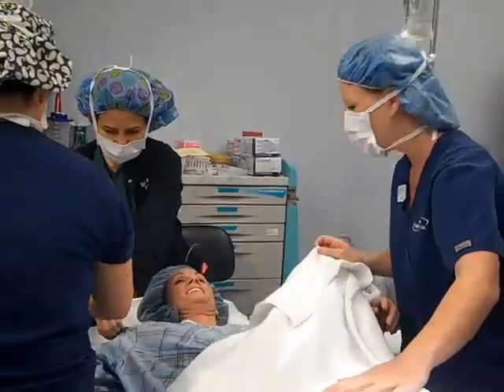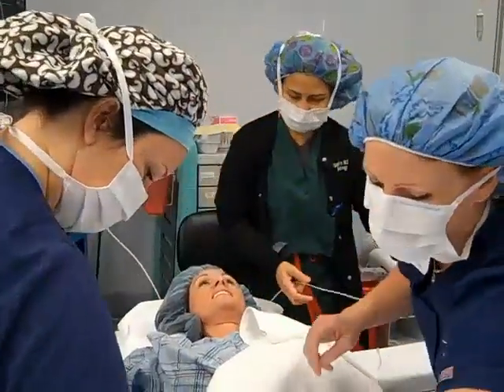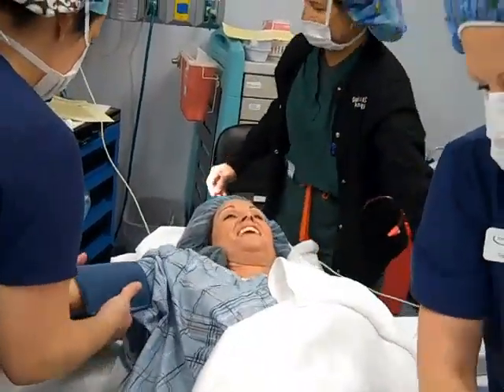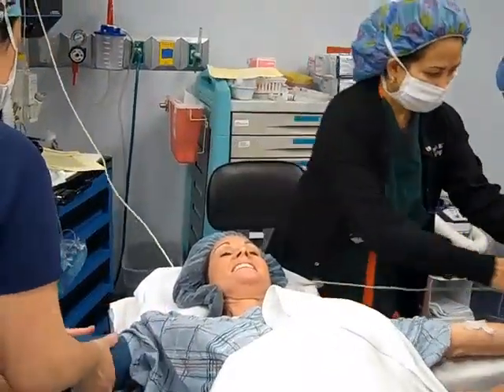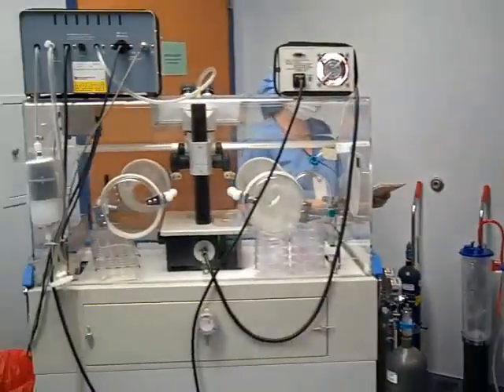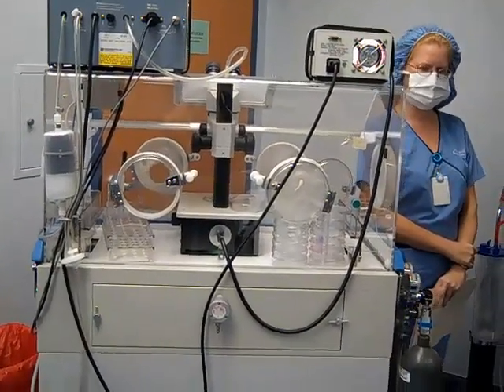We're going to be putting some monitors on you, okay? There you go, just like before. She's still smiling — it's all good. Here we can see the isolate chamber where Liz's eggs are going to be placed.